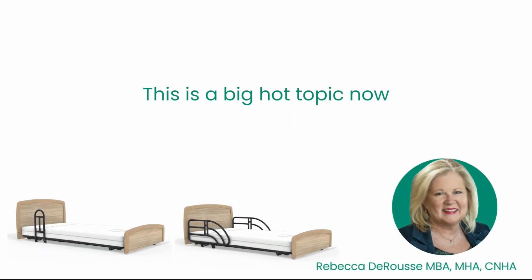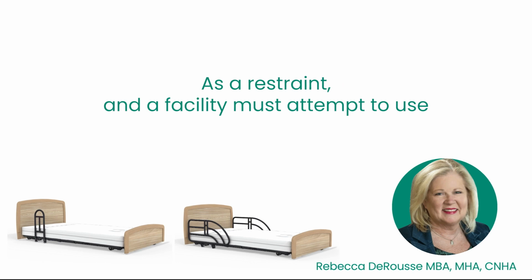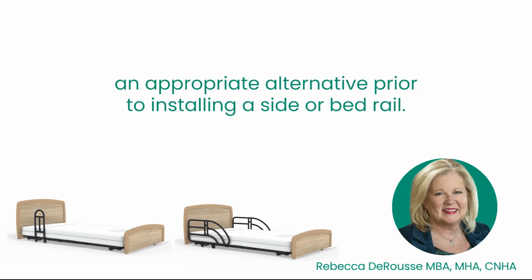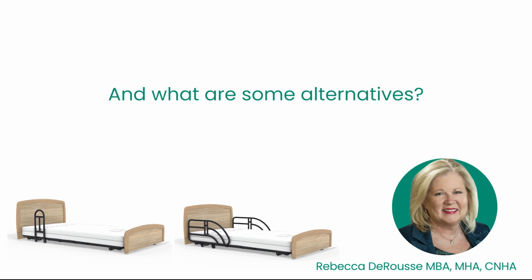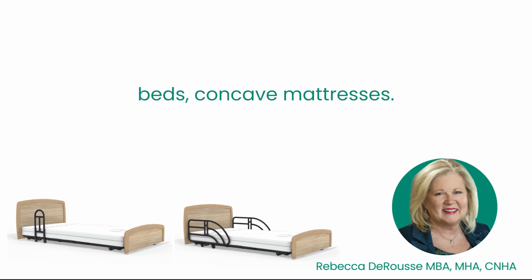This is a big hot topic now. We all know that bed rails cannot be used as a restraint, and a facility must attempt to use an appropriate alternative prior to installing a side or bed rail. And what are some alternatives? It could be a roll guard, bumpers, lower beds, or concave mattresses.